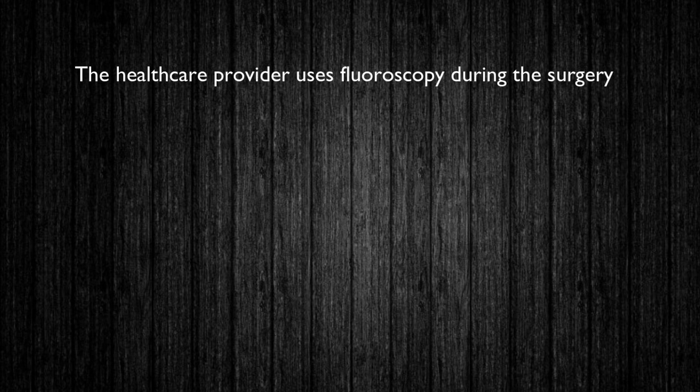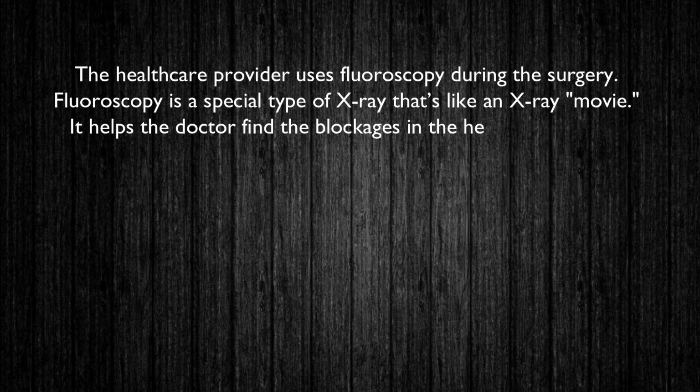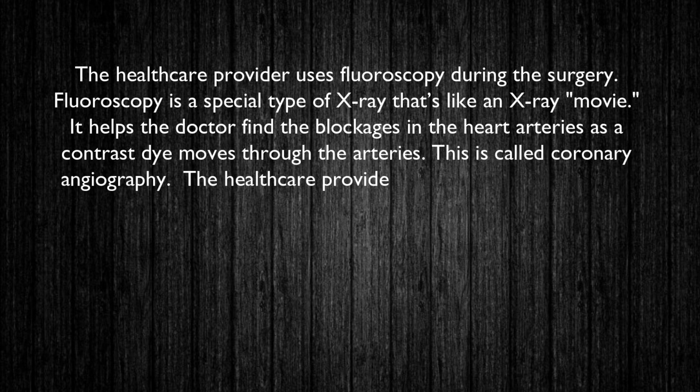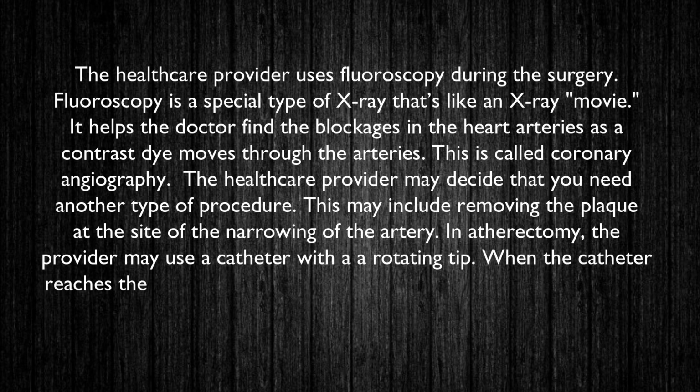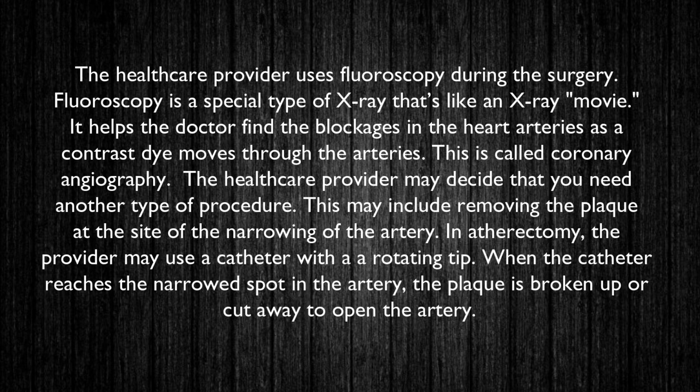The healthcare provider uses fluoroscopy during the surgery. Fluoroscopy is a special type of X-ray that's like an X-ray movie. It helps the doctor find the blockages in the heart arteries as a contrast dye moves through the arteries. This is called coronary angiography.